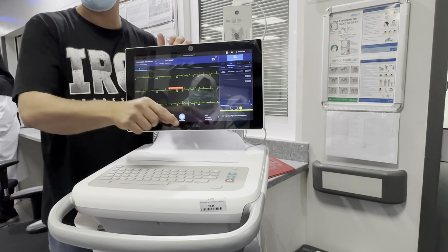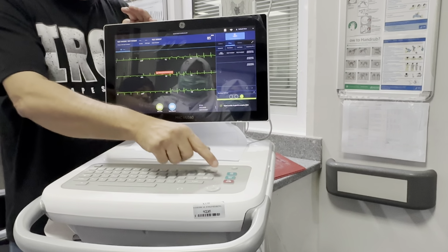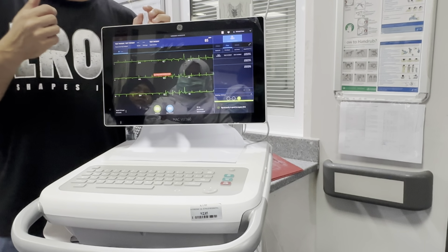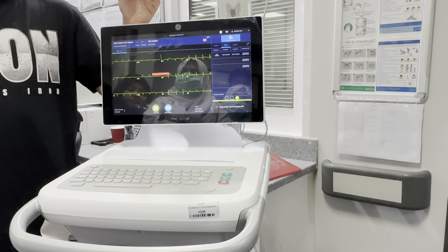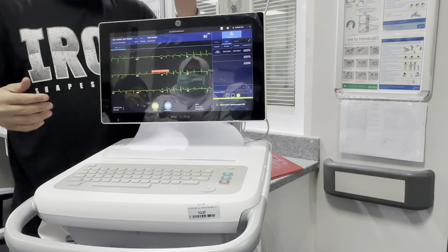So ECG, this is the 12 lead ECG report, the one which we are familiar with. Rhythm report, what's the rhythm report? To check which rhythm. Some physicians call it long leads report, or you'll find your physician asking for 4 pages ECG or 6 pages ECG.